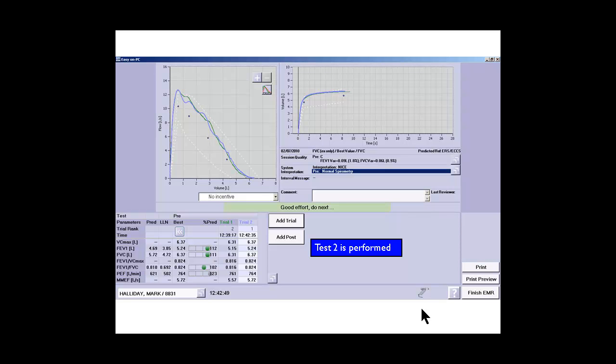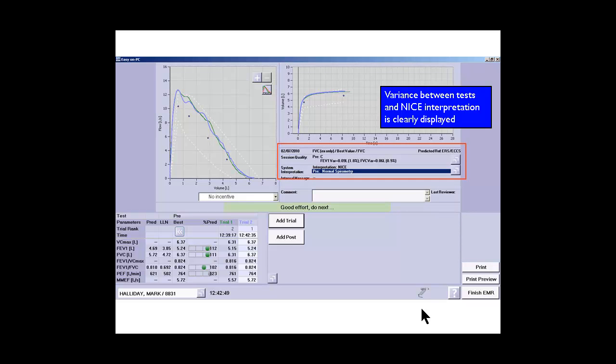We've now got an interpretation because we have the variance between plus or minus 5% and the interpretation is according to NICE and the new gold standards.